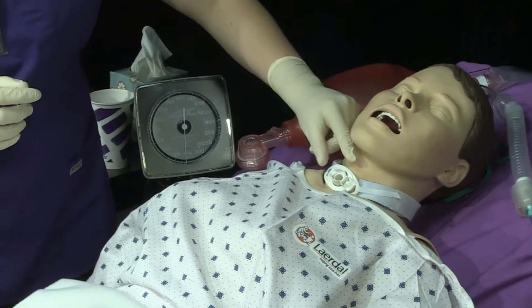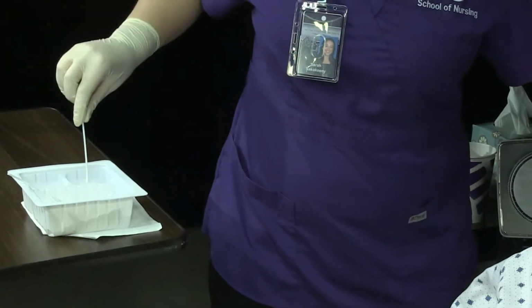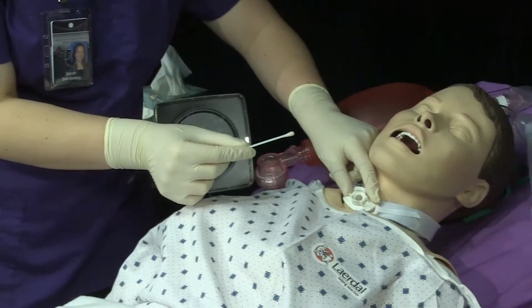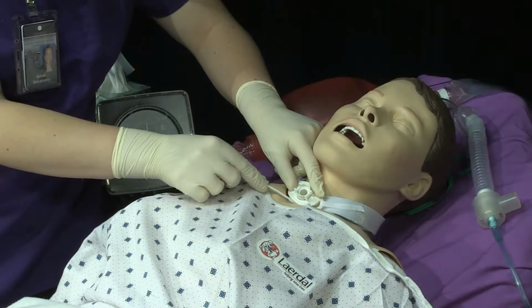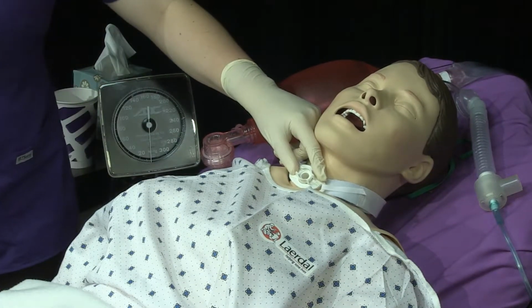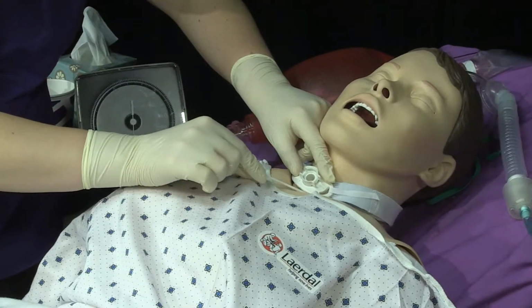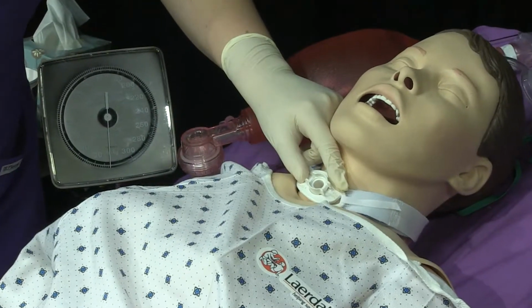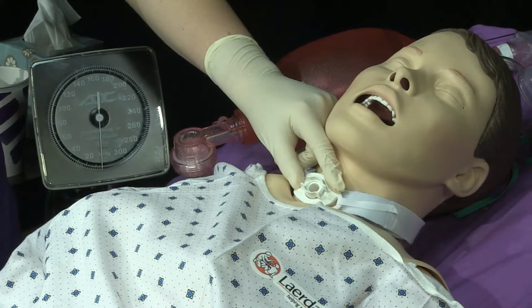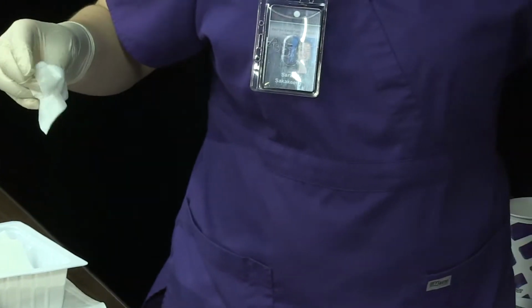Use the clean hand to stabilize the tracheostomy. Dip sterile cotton swab in saline solution. And use a new swab for each swipe. Gently cleanse outer area of tracheostomy. Cleanse from the stoma outward. Pat outer area of tracheostomy dry with sterile gauze.